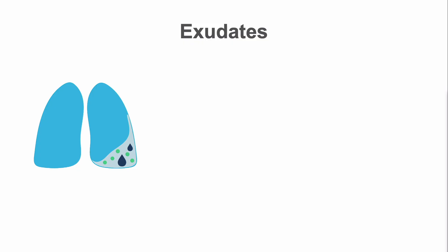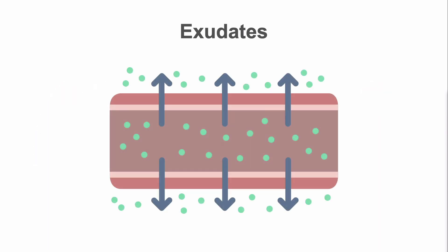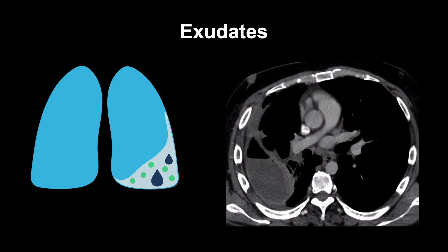Exudates result from damage to the pleura due to infection, neoplasm, or inflammation. The damaged pleura allows a fluid full of inflammatory cells and protein to leak into the pleural space. In the initial phase of an exudate, the pleura doesn't thicken. As the process progresses, fibrin deposition can lead to pleural thickening and loculations, which prevent the fluid from flowing to other areas. So, if there is non-dependent fluid loculated in lens or crescent-shaped collections with pleural thickening, think exudate.